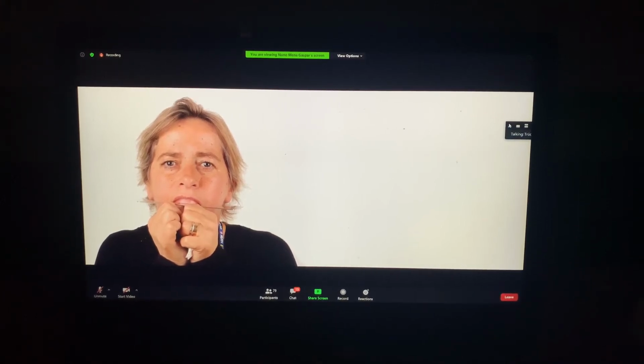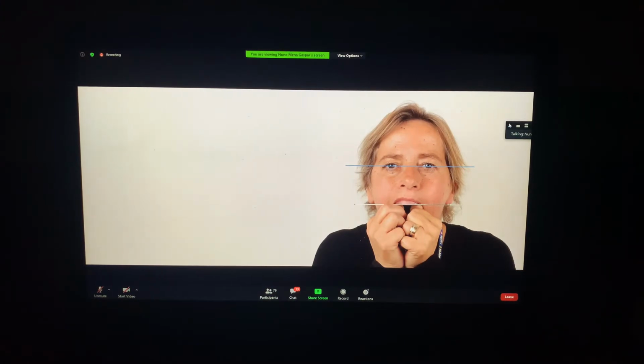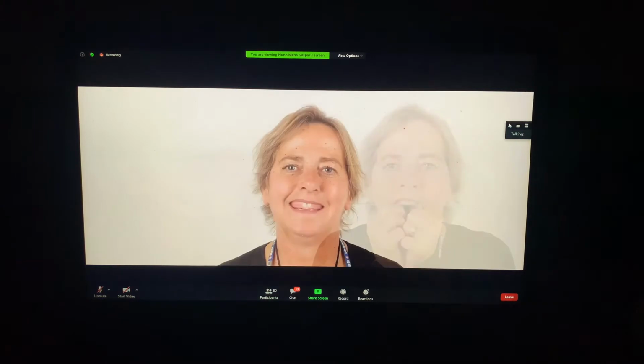Midline. As I said, the occlusal plane should be parallel to the bipupillary line. I set the midline and the upper occlusal plane. So we will need to trim this box to make it parallel, like this. And I made the upper occlusal plane parallel to the pupils. Look how asymmetrical she is. And then with this, I have my occlusal plane corrected.